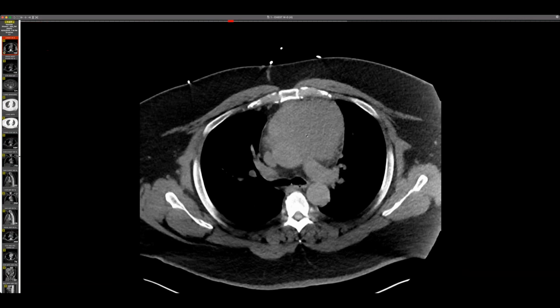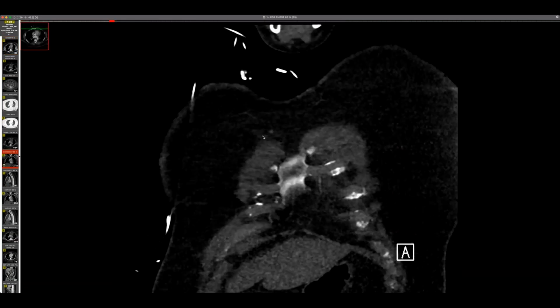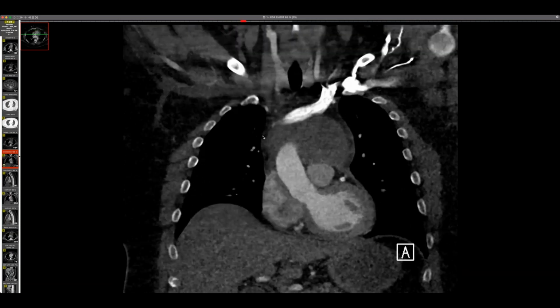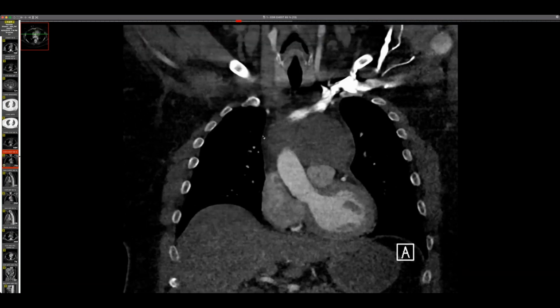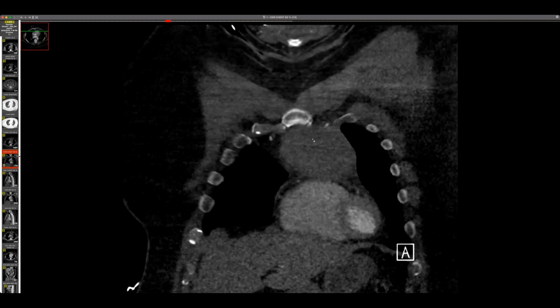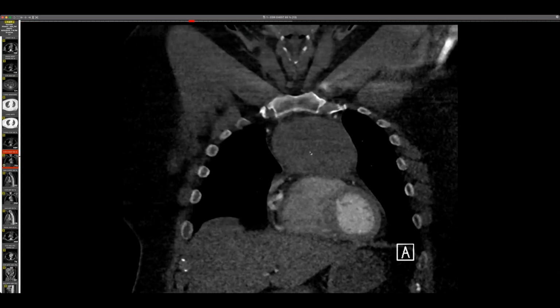Travis, have you seen a few of these? I've seen at least one, and I have no idea if I've seen more than one. I remember it was big like this and had some calcium in it. Certainly less than five, probably less than three. On one of the non-contrast images that I've seen on a different scan, there was a little hint of calcification, fairly faint, a little bit of whiteness in there on a non-contrast scan. This is contrasted, and I don't actually see the whiteness in there now.